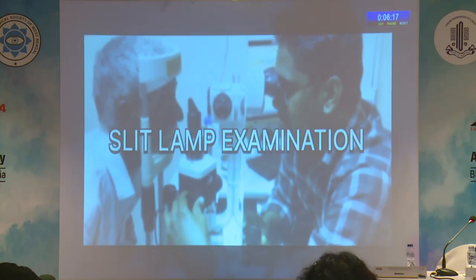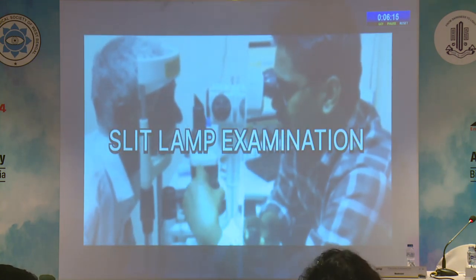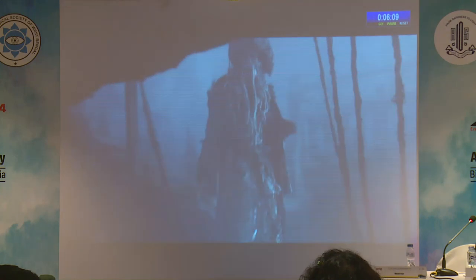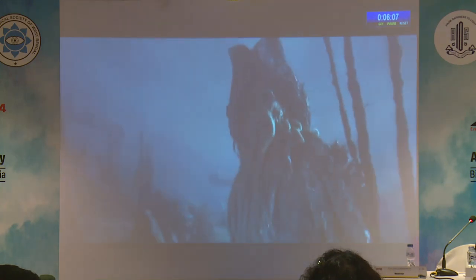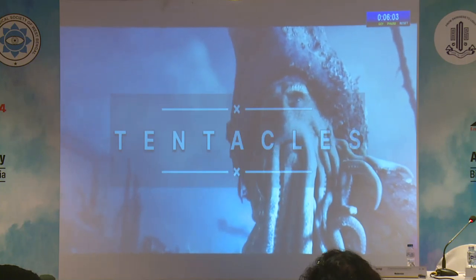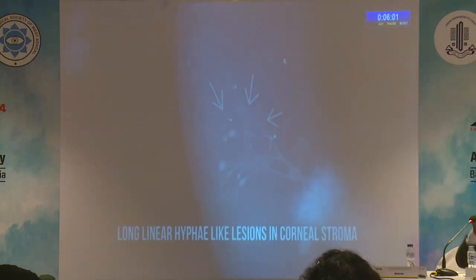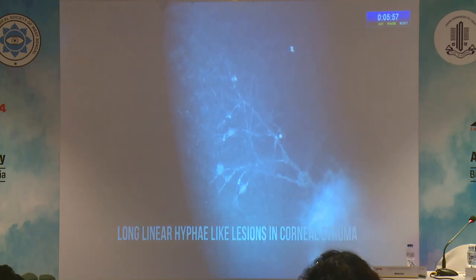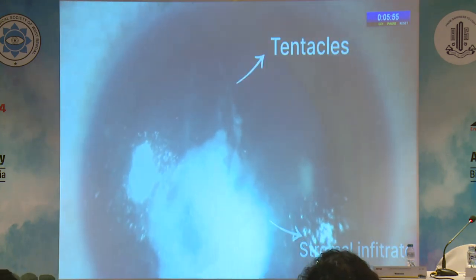Recognizing specific slit lamp features is pivotal for early clinical suspicion. The first sign being tentacles. Tentacles are long, linear, hyphae-like lesions in the corneal stroma with or without stromal reaction.